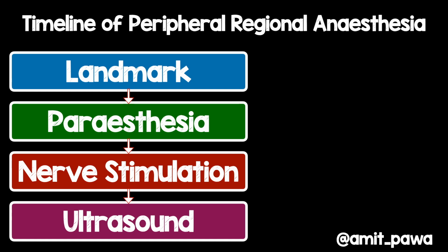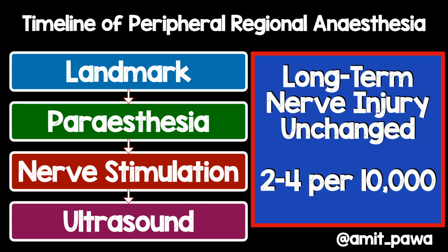of peripheral regional anaesthesia. So back in the day when Dr. Gadsden started practicing regional anaesthesia, people were just using landmarks, and then they moved on to paresthesia, nerve stimulation, and ultimately ultrasound. Now one would hope that as you've gone from more primitive, let's say, techniques to the more advanced techniques, that there would be an improvement in the safety of regional anaesthesia. Sadly, the long-term nerve injury risk is unchanged at about 2 to 4 per 10,000.